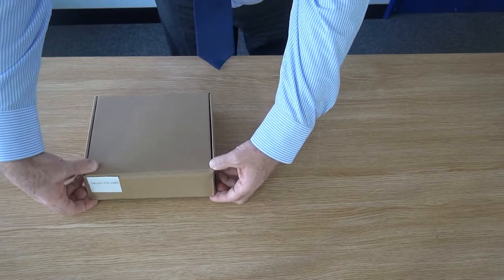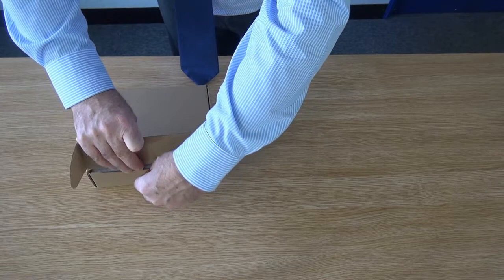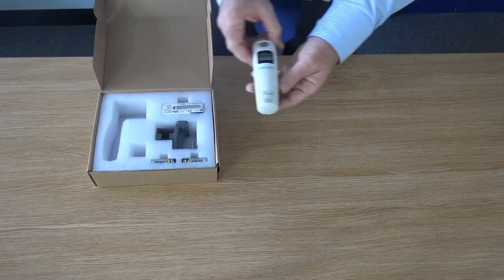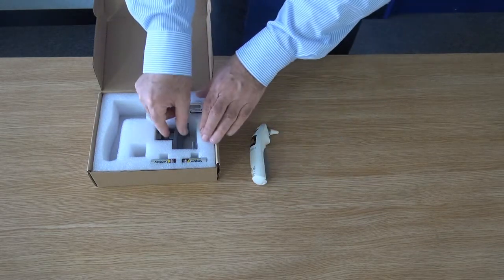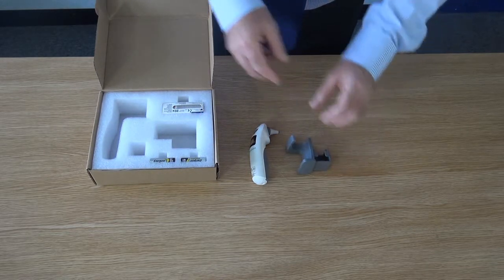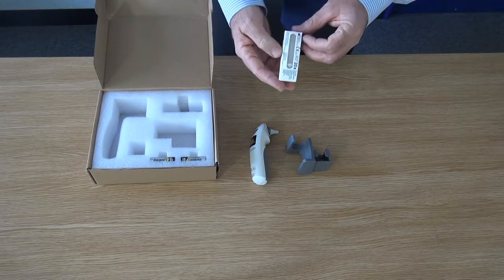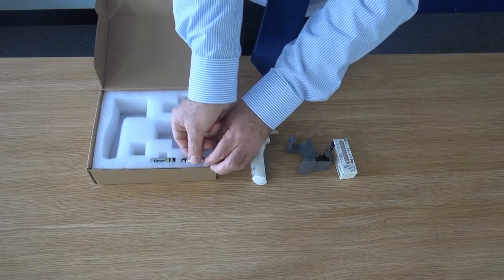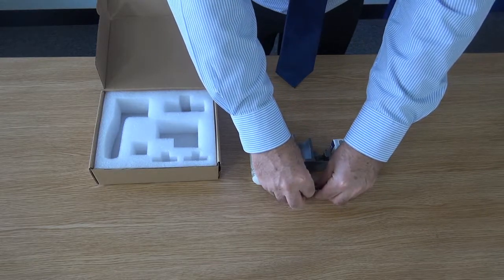Carton number two contains the accessories and consumables for the temperature probe. The temperature accessory carton contains the following standard items: one wireless temperature sensor, one cradle, a pack of 20 temperature lenses, and two AAA alkaline cells.